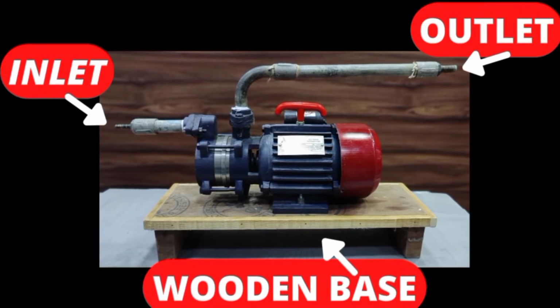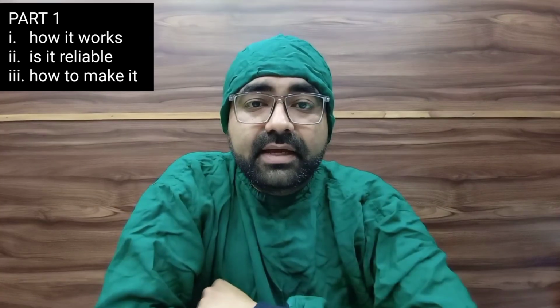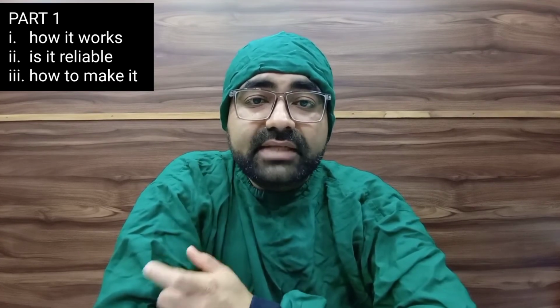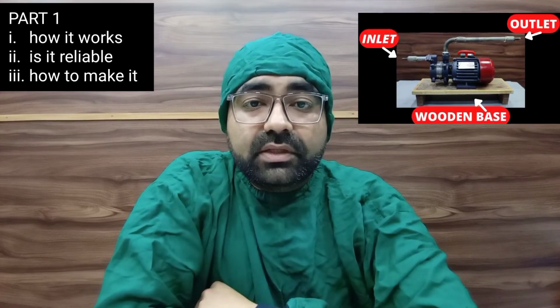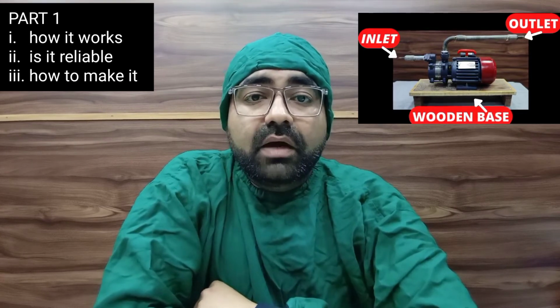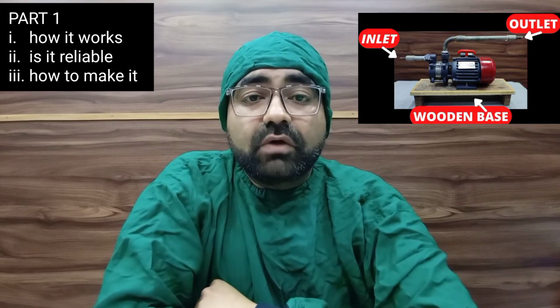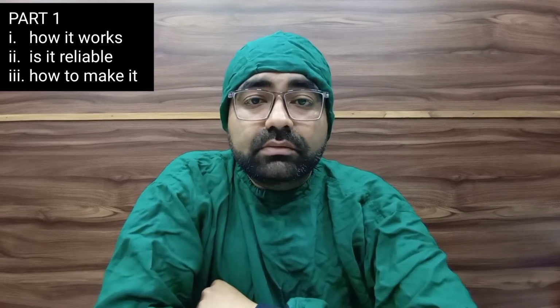The inlet of the water pump will be used by us as a suction inlet and the outlet of the pump will be used by us to throw out the suction liquid into the drainage line. The wooden stand that you see in this picture is custom made and it is easily available. A wooden stand gives the firm base to the water pump. It also reduces the vibration of the motor and keeps the motor pump steady on the ground.